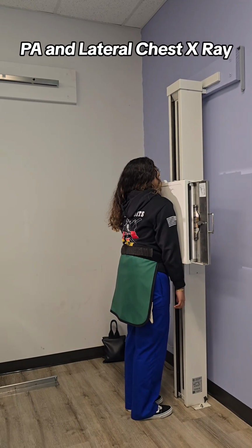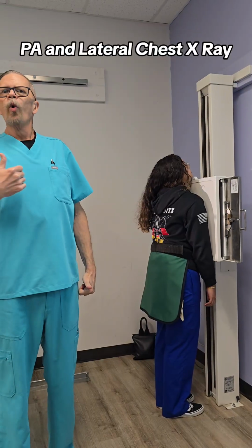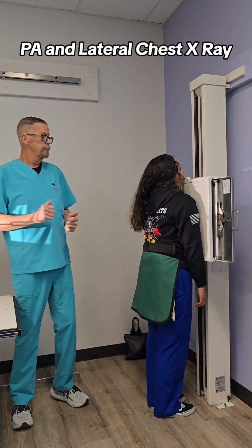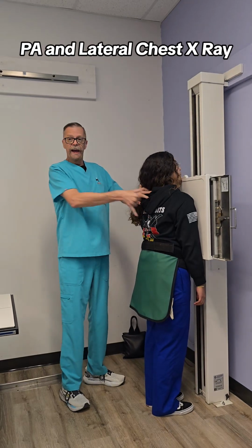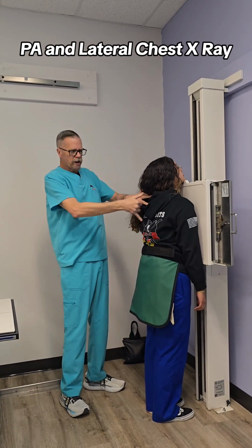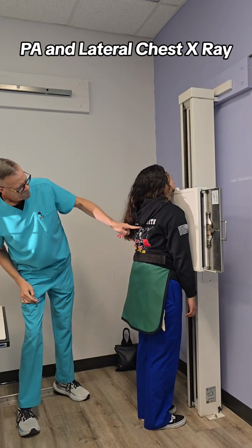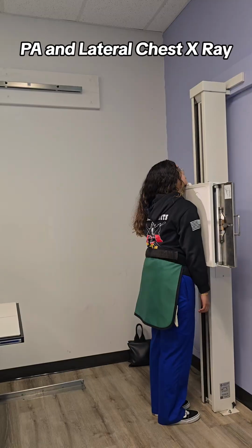We do want that central ray about 7 to 8 inches inferior from the vertebral prominence. Or at what thoracic level do we want the central ray hitting? T7, which is right about the middle. The way we would do it is find that vertebral prominence, using the hand spread method, thumb and finger. This will indicate about 8 inches, so I would shorten it up a little bit for females. That looks right at that level. Again, in the x-ray room, you're going to have all the lights off, so it's easier to tell.